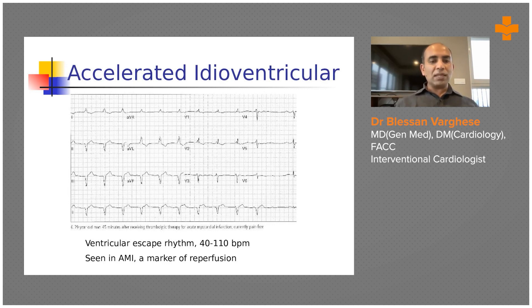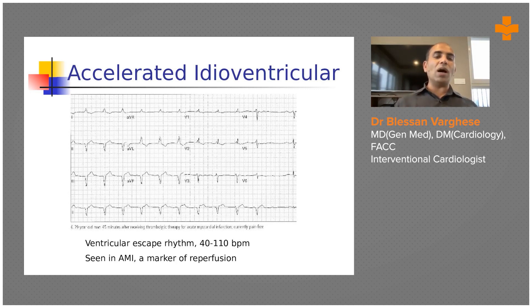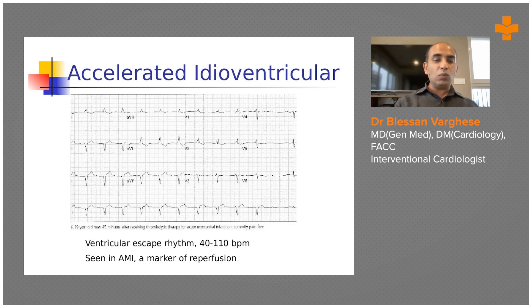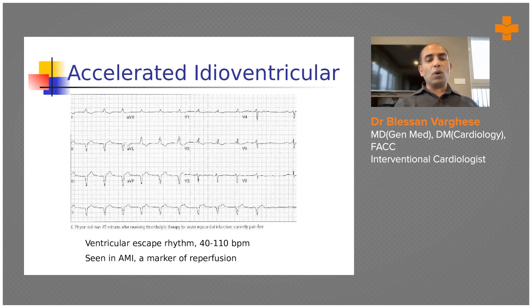In this ECG you can see there is no P wave preceding the QRS complex. In leads 2, 3, and AVF there is no R wave - rather a Q wave - and there is ST depression in leads 1 and AVL. In some leads you can see a small P wave embedded in the QRS complex - an inverted P wave visible carefully on the ST segment.